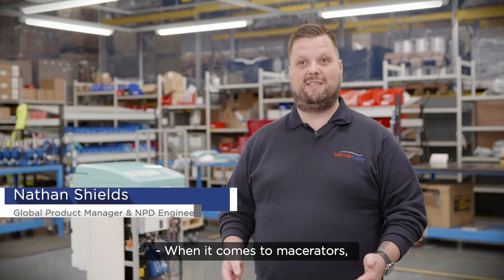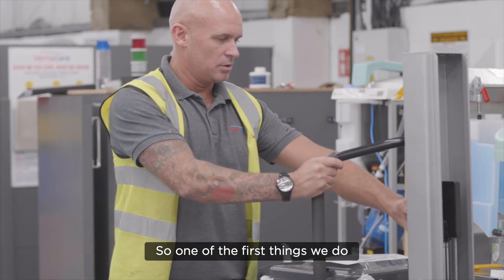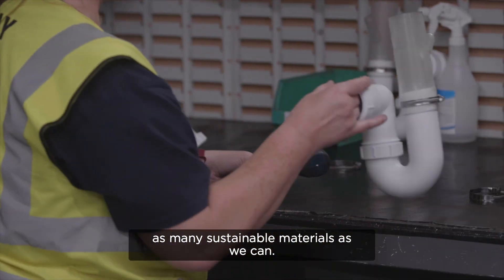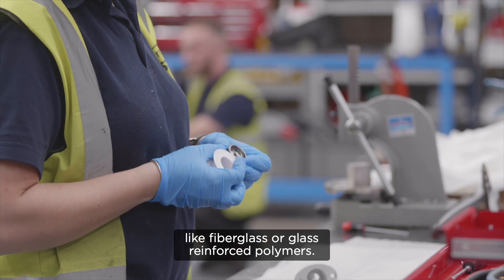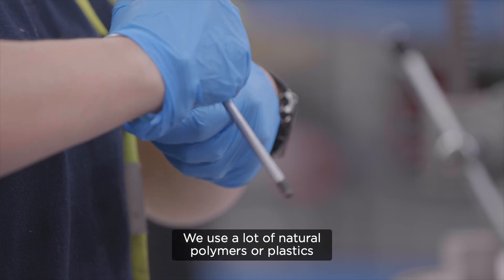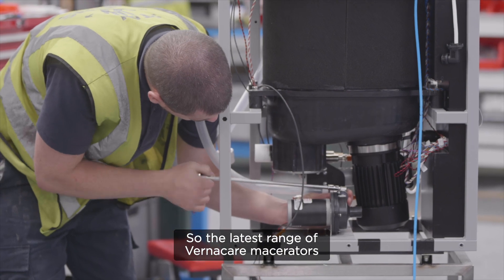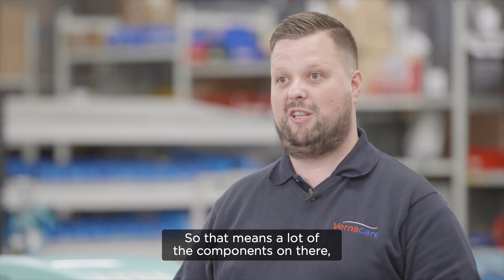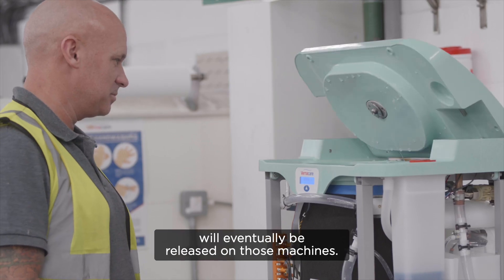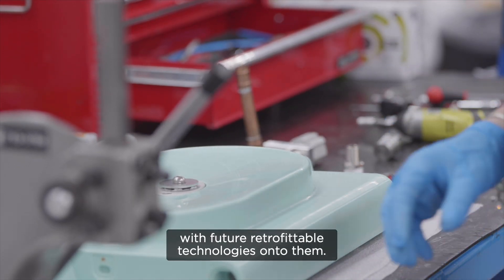When it comes to macerators, sustainability starts with the design process and the design methodologies that we implement. One of the first things we do is look to source as much as we can locally. We also select as many sustainable materials as we can — in the past we used things like fiberglass or glass-reinforced polymers, but we tend to move away from that now, using natural polymers or plastics which are readily recyclable. The latest range of Vernacare macerators have been designed with future-proofing in mind, meaning technologies still in development will eventually be released on those machines, keeping existing machines running longer with future retrofittable technologies.